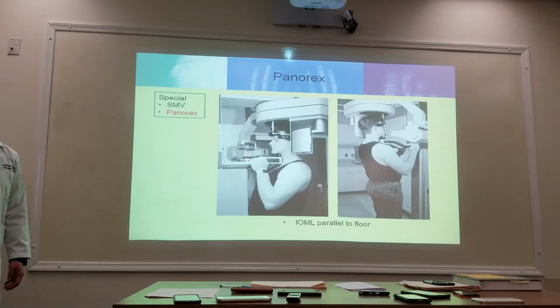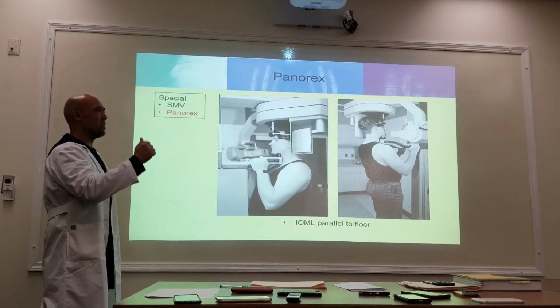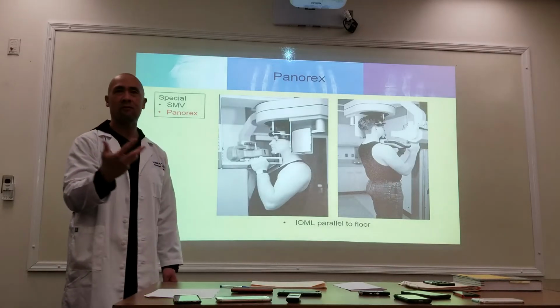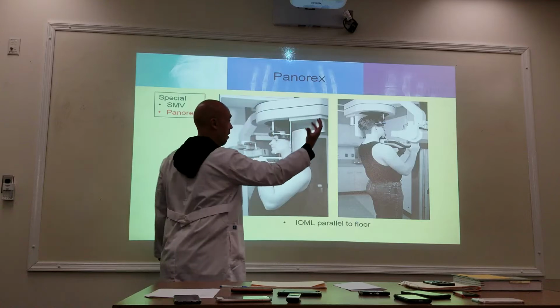Panorex. Any of you have Panorex at your facility? Has anybody had a Panorex done before for dental work? Here it's one single image, and as they're making an exposure, the exposure can be anywhere between 3, 4, 5, 6 seconds as the X-ray tube makes its way around your face.